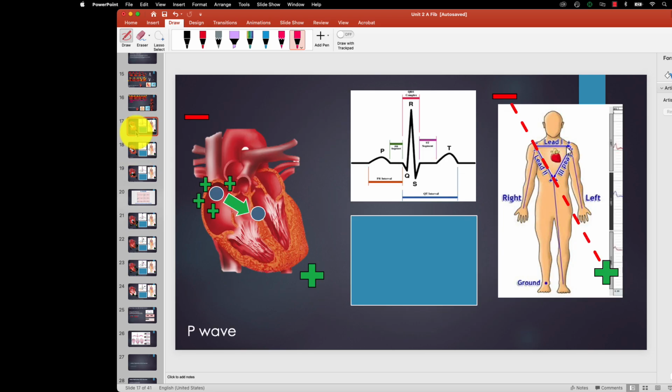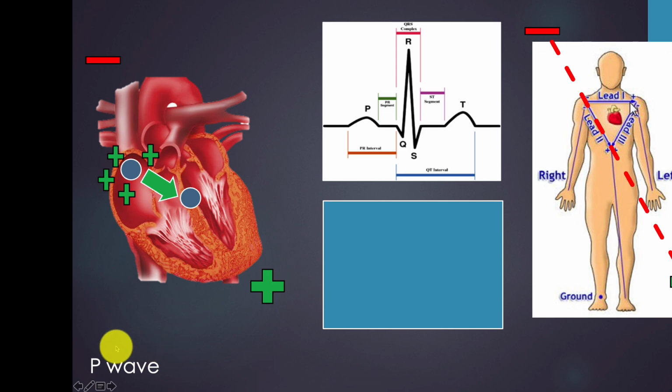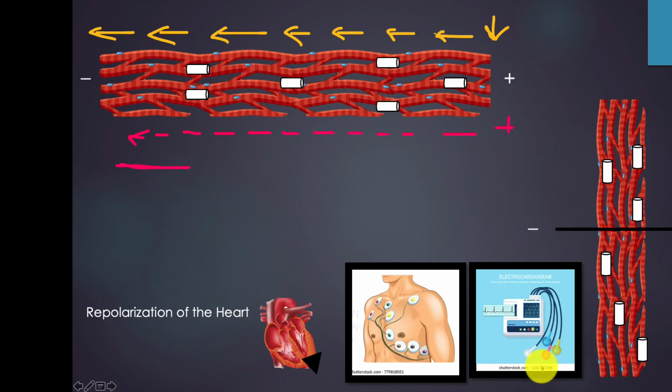So let's go through why all of this is relevant now and discuss why I went through this with you. Okay, so when we put an electrode on somebody's chest, if we're trying to determine myocardial infarction or AFib, we have 12 leads that we usually put on somebody. And a lead, let me go back, these are leads or electrodes, right? We have 12 leads that we usually do. Number 2 lead is usually the most important lead. Well, they're all important, but number 2 plays an important role.